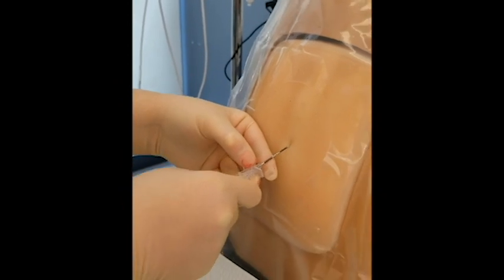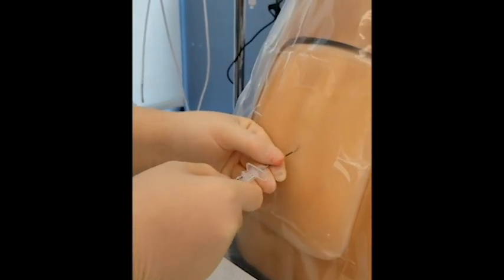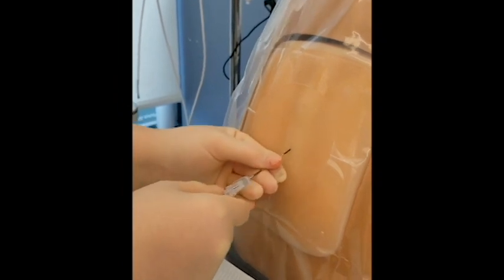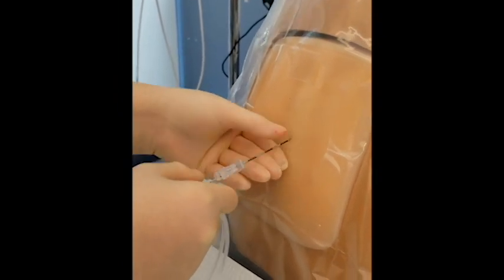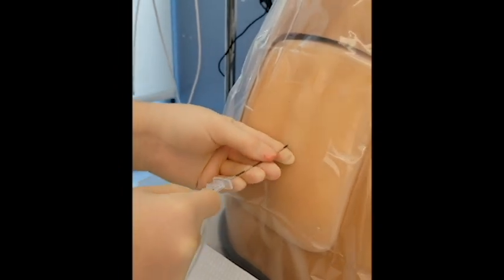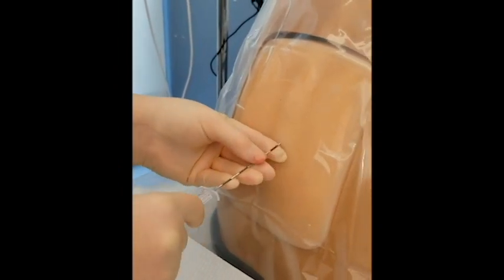Insert catheter while removing the Tuohy needle. Once the catheter is exposed at the skin, hold the catheter at the skin while removing the needle completely from the catheter.